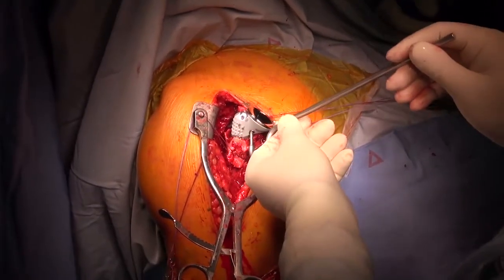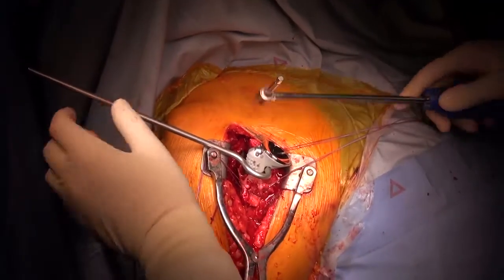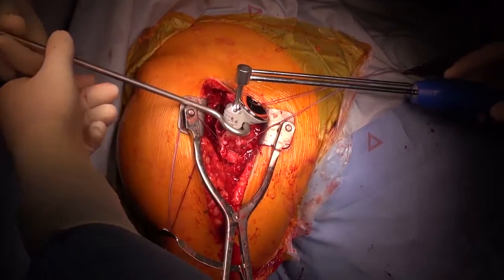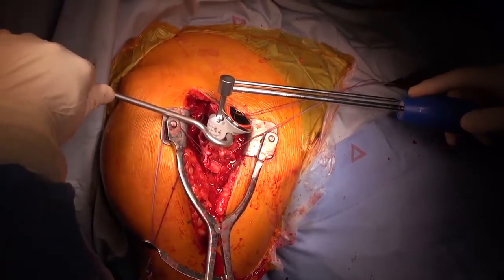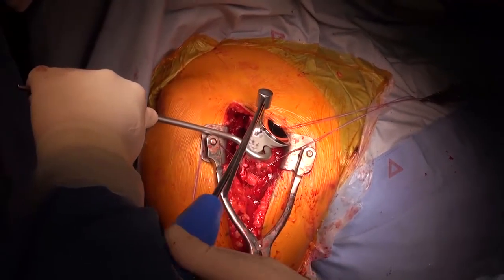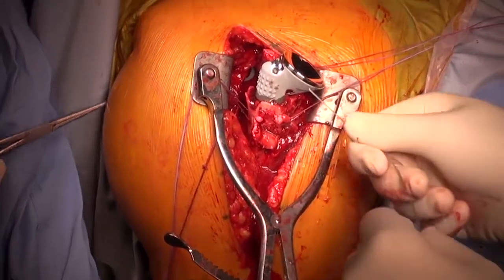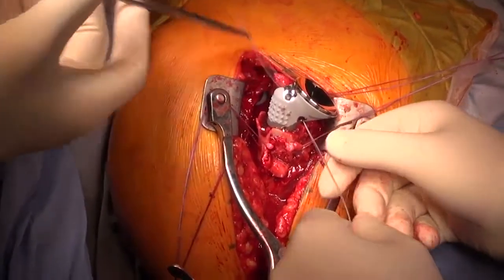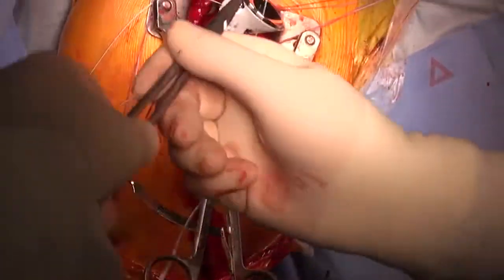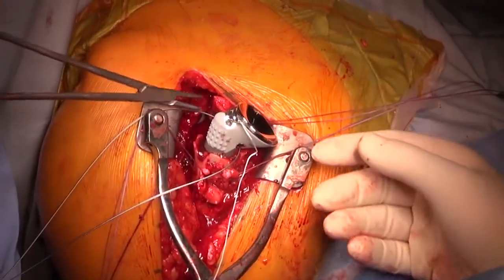Secondary loosening is prevented by tightening the body with a torque wrench and counter wrench. Deformation of the pointer to the edge of the handle shows the appropriate torque was achieved. Insertion of a titanium cable through the lower transverse hole and a non-resorbable suture through the upper transverse hole for the refixation of the tuberosities.